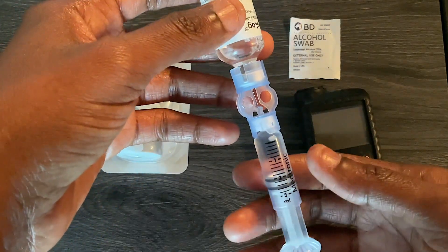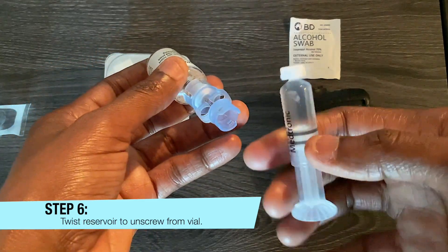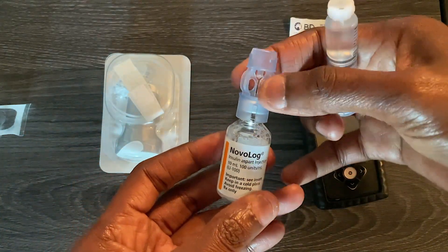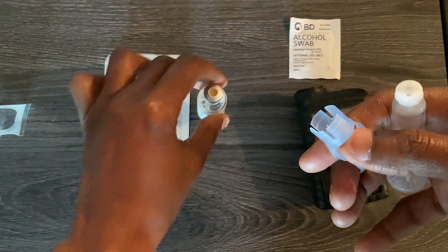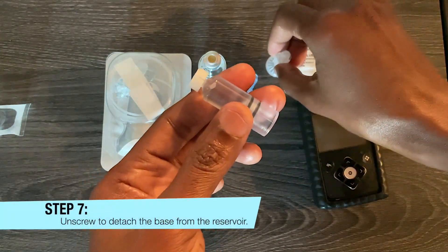Precisely at number two, unscrew by twisting the reservoir off of the insulin vial. Remove the needle, then unscrew the bottom from the reservoir and set it down in the meantime.